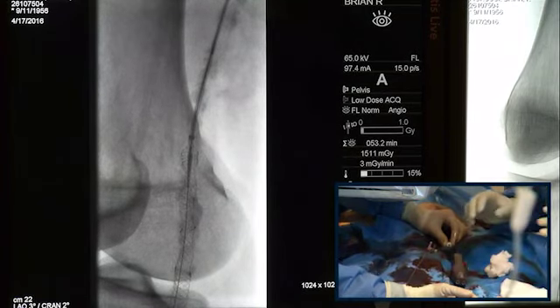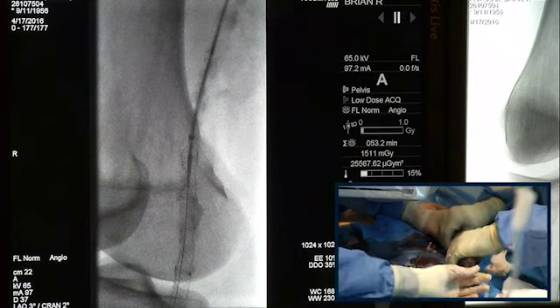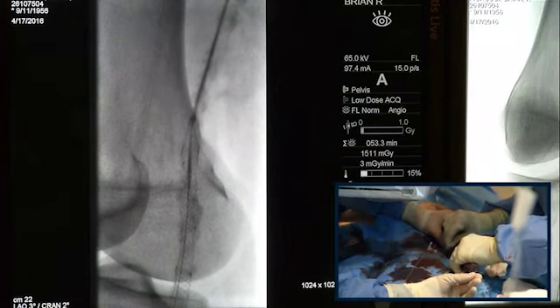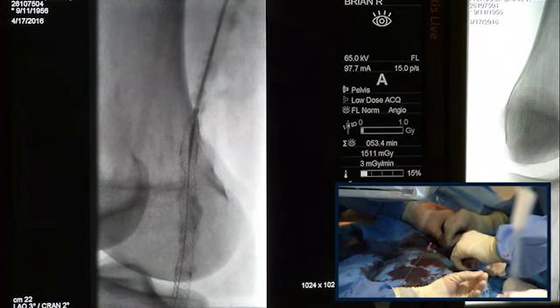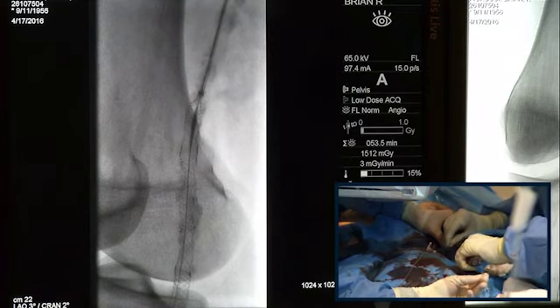The other issue is that sometimes if it elongates, you can then stack it right after. Right. So try to, you know, Andre, can you comment on that, or Craig or somebody? Yeah, you see, there are areas where the stent is very densely packed, as now, where the tip is moving upwards. So you can call it some kind of depot of wires. And then it may approach an area where it's a little bit more difficult to pack. And because of those depots of more dense wires, over time you see that the stent evens out more, and the appearance gets more regular, because you have some depots of wires which then can move upwards to those areas where it's not so much packed.